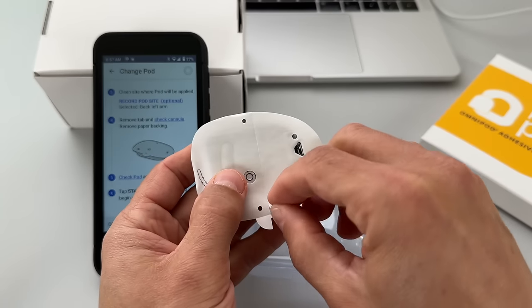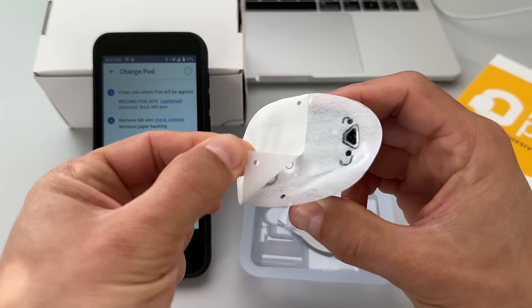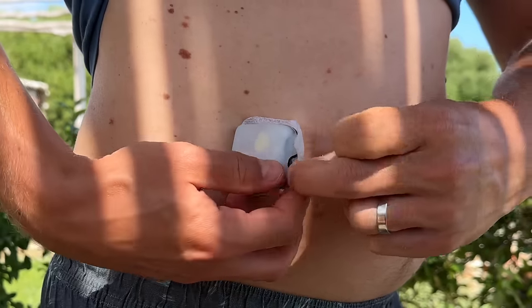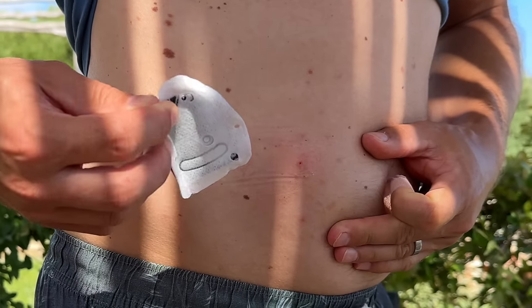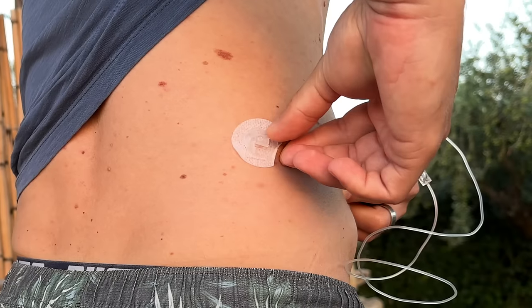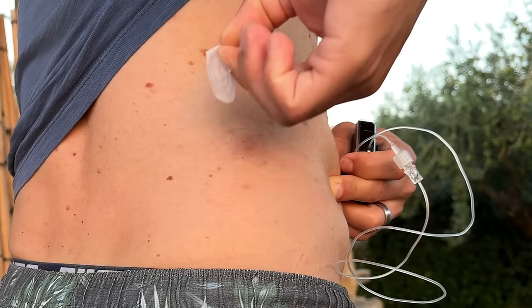One thing to consider is that the pods are fully disposable and must be replaced every three days — once every three days you throw the whole patch pump in the trash. On the other hand, it's very easy to switch from Omnipod to a different system — you just stop ordering pods and you're out. The T-Slim X2 has a four-year lifetime; the only things you replace every three days are the cartridges and infusion sets. But it's not easy to switch once you sign a four-year contract with Tandem, so you'll most likely end up using it for the full four years.